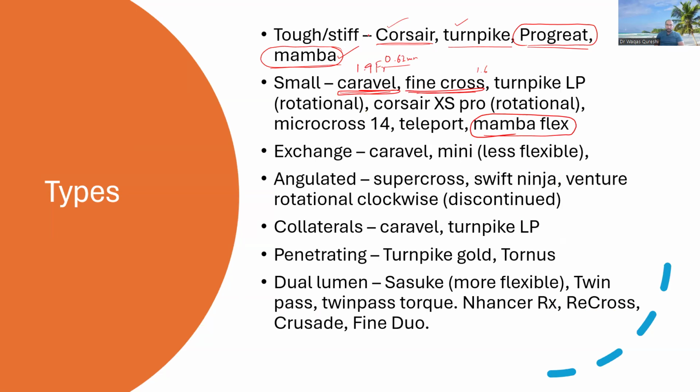It is a soft tip. The issue with that is you don't want to rotate it, because sometimes the tip can get stuck, and I have seen cases where the tip got stuck and the tip broke off the Caravel.